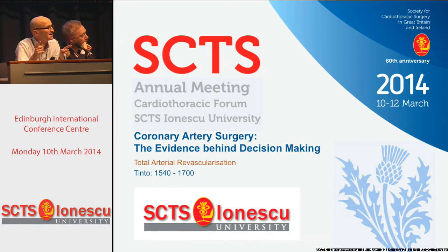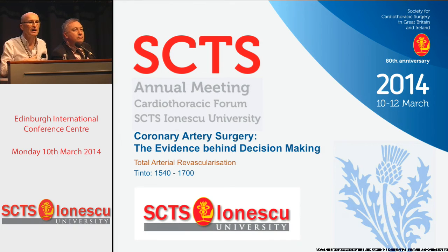And what has happened since then has been a major improvement in this system. The original system was just TTFM. It's made by Medistim, and they now have a new system called VeriQC. What this does is combine TTFM with a small echocardiographic probe. And the crucial thing about this is it allows you to visualize the anastomosis. Because many of the grafts we were revising before was because of competitive flow in the native circulation, but we couldn't be sure about it.